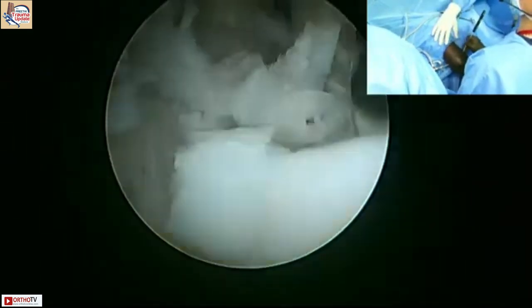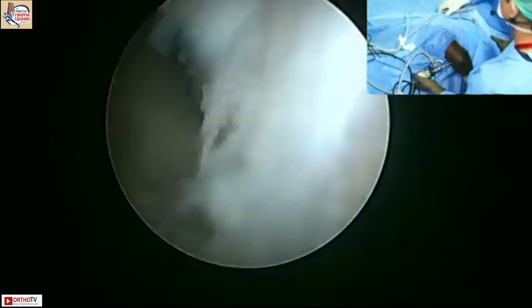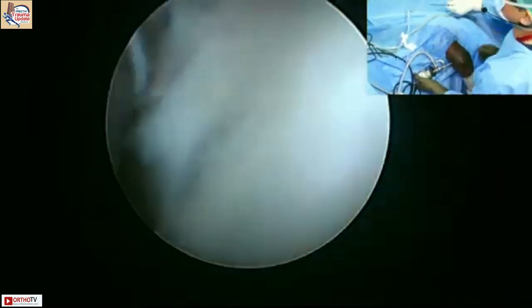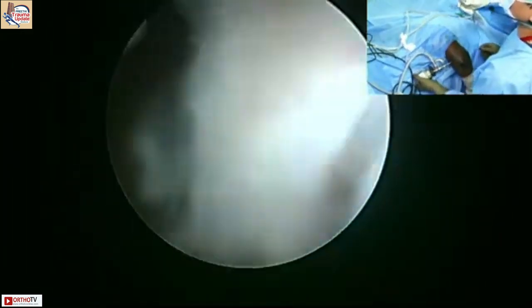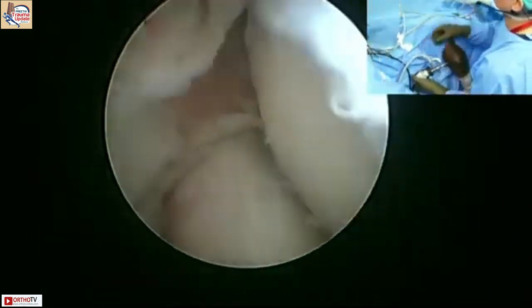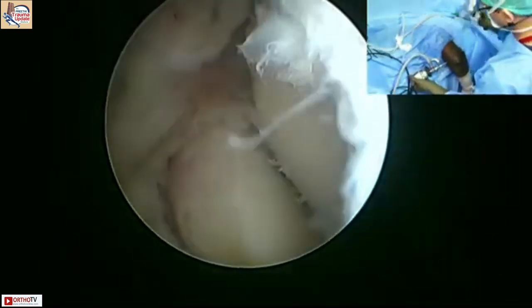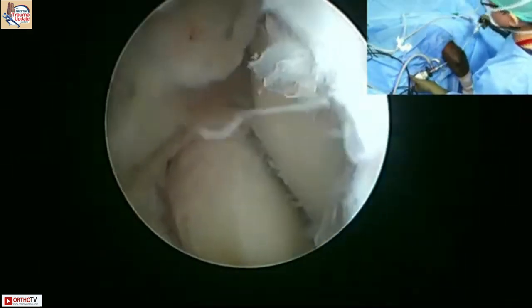Okay, so I've taken off the tip of the coronoid. All right, give me a shaver. Grasper or shaver, whichever, and then that is it. So we are done in the anterior part. Okay, so if you want to do a capsular release, you have to go up. You have to have another portal to go up and then do the capsular release from there.